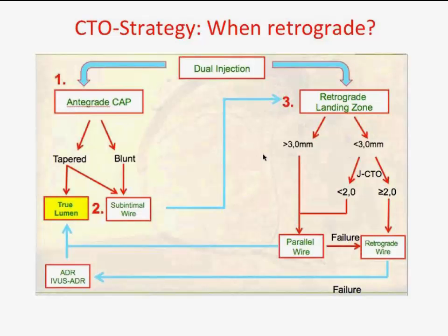And then sometimes we do retrograde first if the cap is not very clear or the patient has failed antegrade before. Do you ever do this, or do you always try antegrade anyway? That's a question many people ask. Do you always try antegrade?